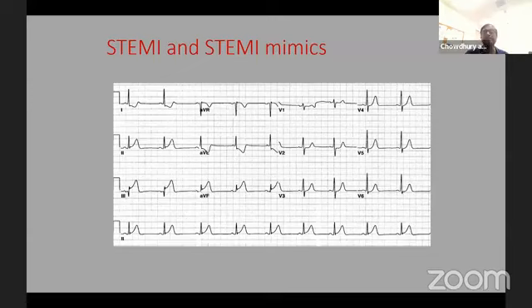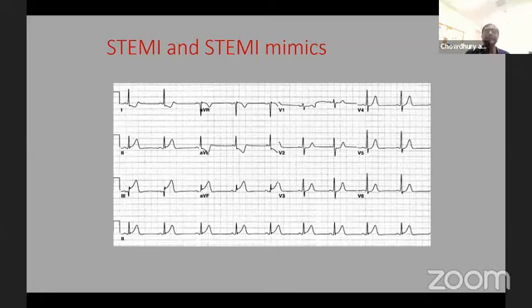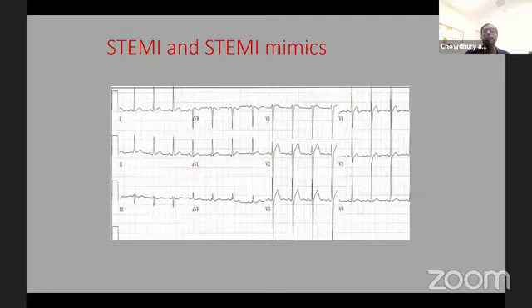Inferior ST segment, some ST changes, T wave upright in V1, V2, and R predominant. Before calling it infero-posterior, make a habit of asking how the patient presented. What is happening at the bedside? Is the patient hypotensive? Are we dealing with an RV infarct? It is very important because that will determine the course of the patient. This patient came in with uncontrolled hypertension, not feeling well, in the emergency room. They called you STEMI. What do you do?